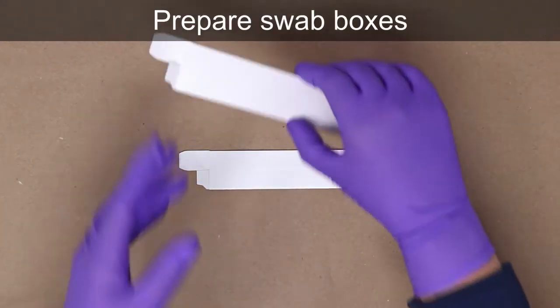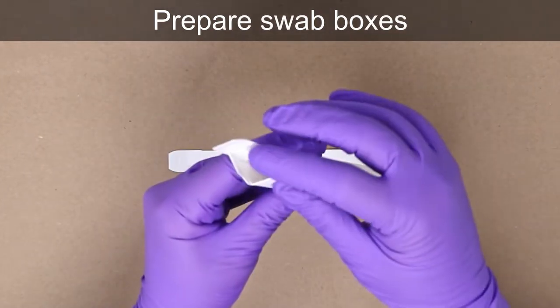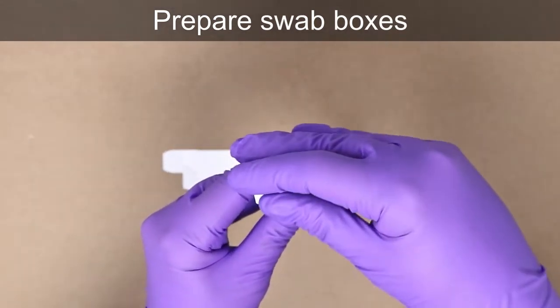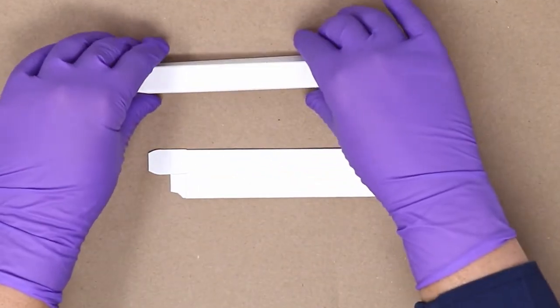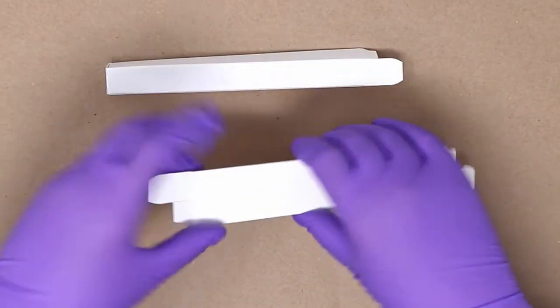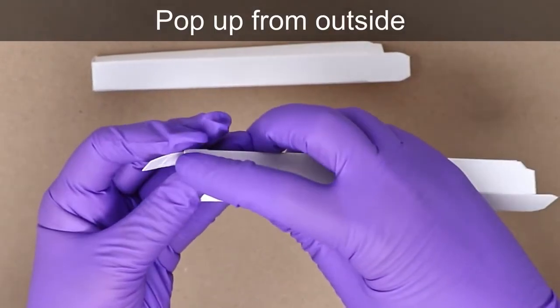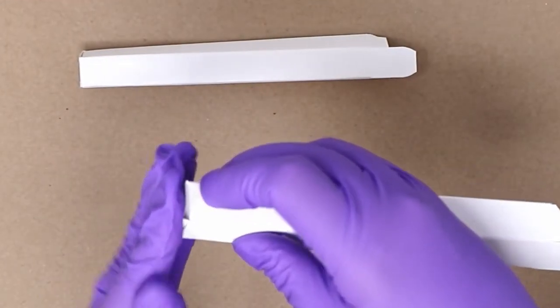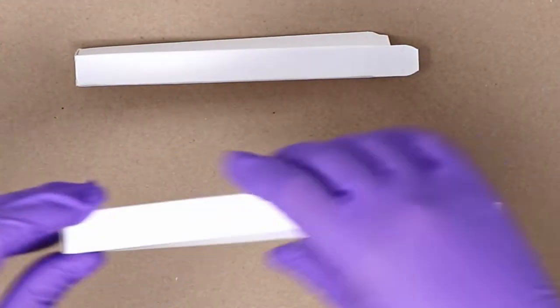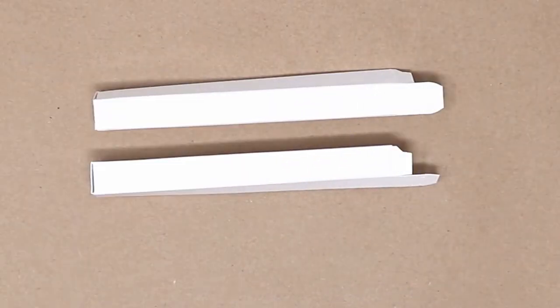The swab boxes themselves come flat packed and must be prepared in advance. Preparing the swab boxes should take place by putting pressure on the outside and not placing fingers into the boxes to help pop them up. This is to avoid contaminating the inside surfaces of these boxes. It is best practice to prepare the swab boxes in advance so that the swabs, as they are collected, can be put into a safe and secure place.